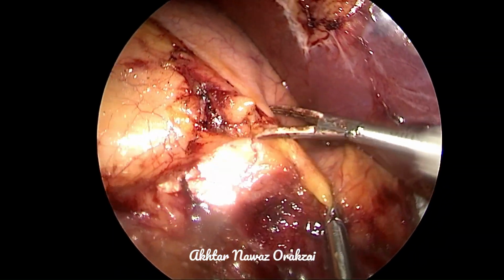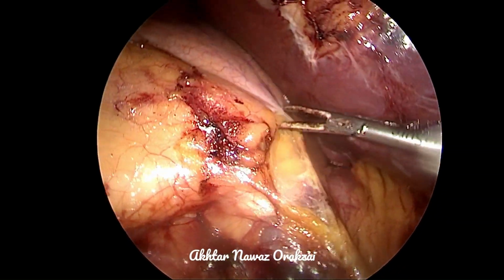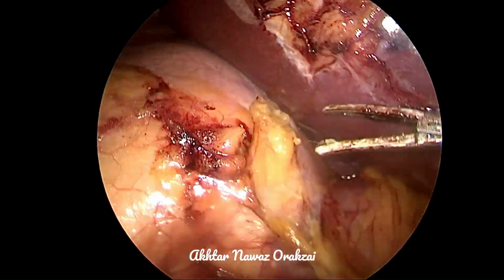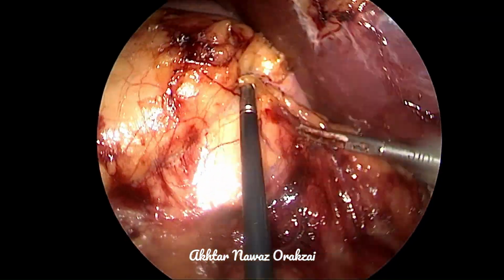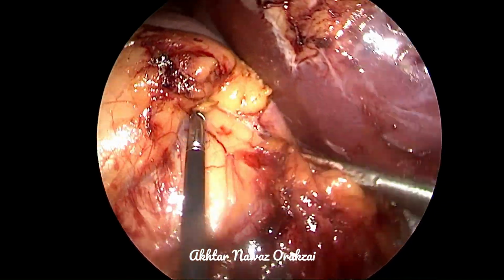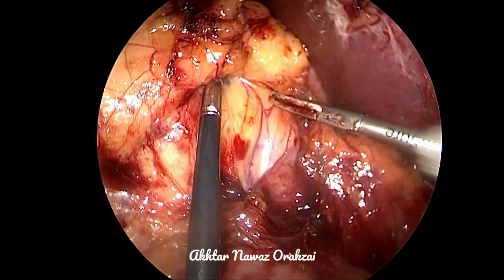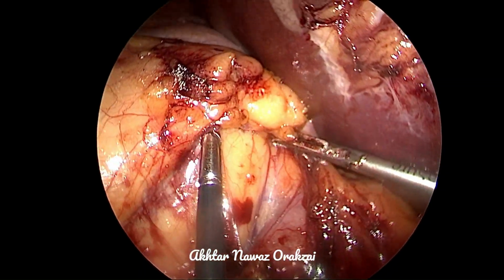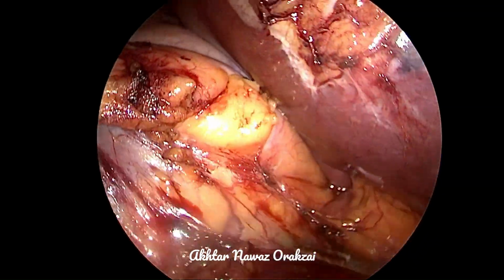That will also be dissected away from the plane of dissection and mobilized medially. Now we have found an avascular plane here, and hence the duodenum is mobilized and dissected away medially.